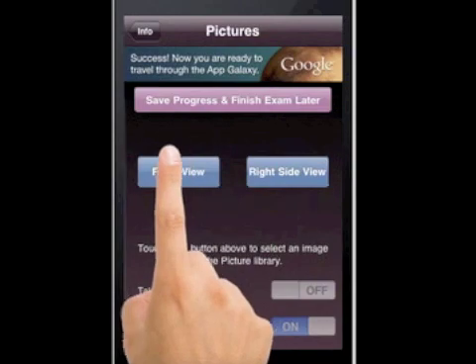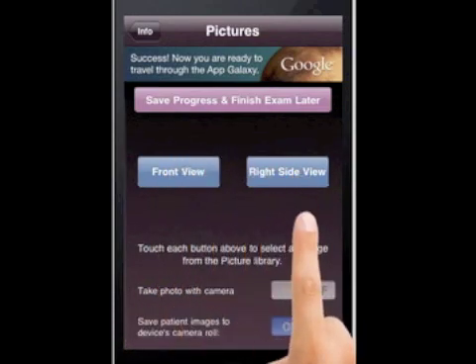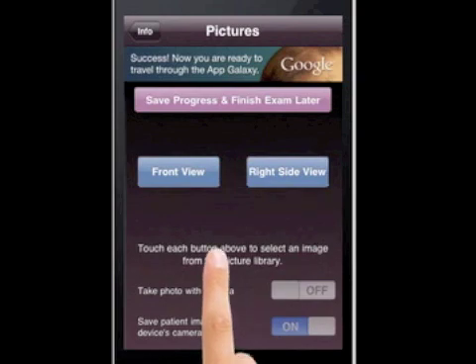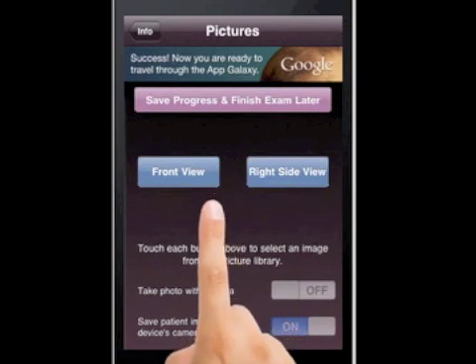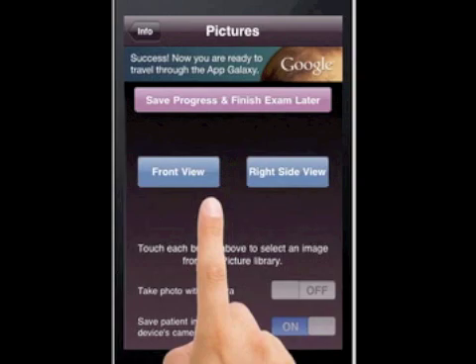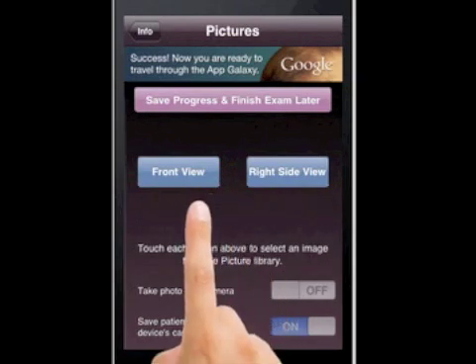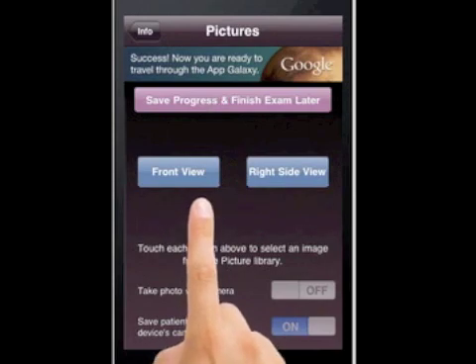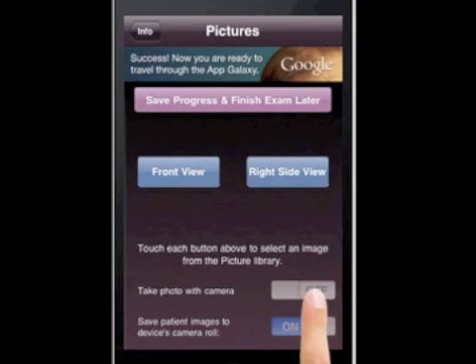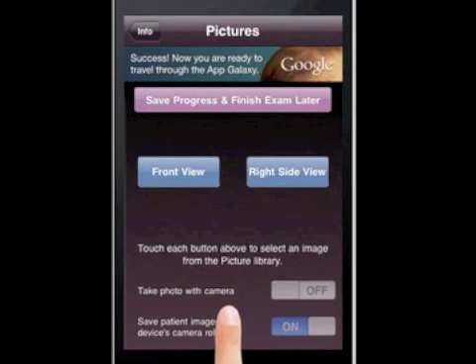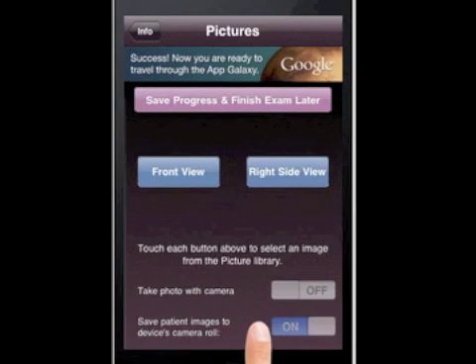If you're going to take pictures on the device, you'll start with the front view and then the right lateral view. Since I'm using an emulator on my MacBook, you won't see me taking a picture using the heads-up display — I'll have another video for that. If you wanted to use a picture from the camera roll on the phone or iPad, all you would do is click this to off. By default it won't save images back to the camera roll, but if you were taking pictures from the camera itself, you have the option to save directly to the camera roll so you have those raw, unedited, unmarked pictures.